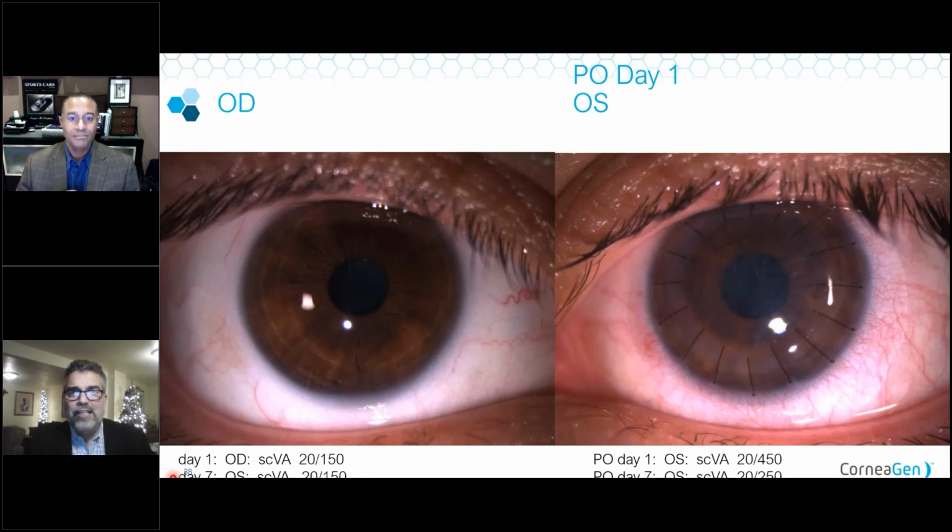Very good. Here's another question. Do you ever run into adhesion and need a blade? There have been cases where I've used a blade. In fact, when I started doing this, at least the way Dr. Goosey taught me, we used a blade just to pull the tissue and use the stretched stromal fibers and gently touch them with a blade all the way across the cornea. What I realized with time, the more and more I did these, was that the blade just really wasn't necessary. It's just a matter of putting enough traction on the cornea, and the cornea is going to dissect on its own. So rarely ever would I use a blade, and I'm really trying to avoid that because that's where you get into issues with perforation.